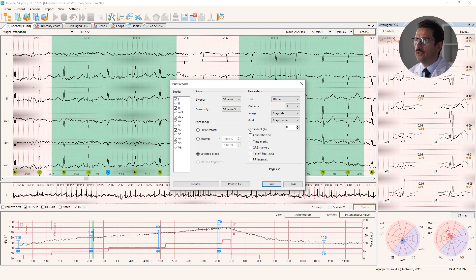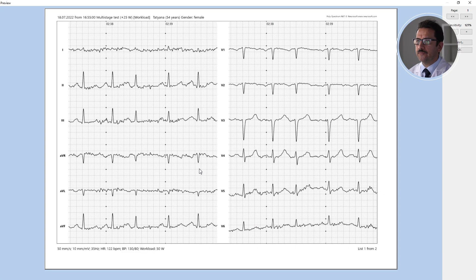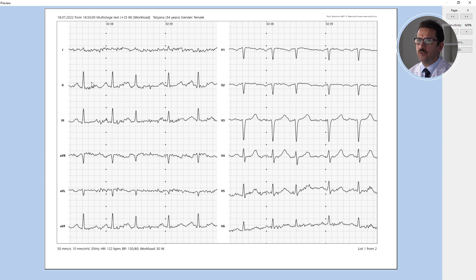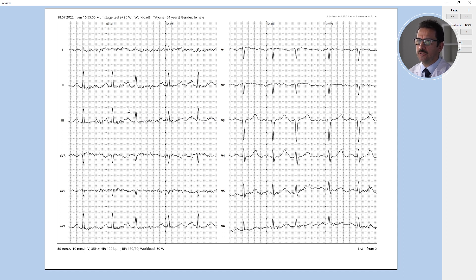I prefer to print right now. Here I can select settings like number of columns — two columns is good — landscape or portrait view, grayscale, and graph paper. I can preview the printout. It's quite good, I can see the extrasystole on the standard graph paper. What is important is why I prefer this option: the printout is metrologically correct.